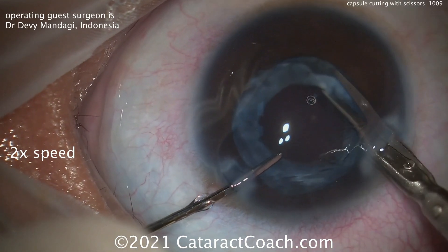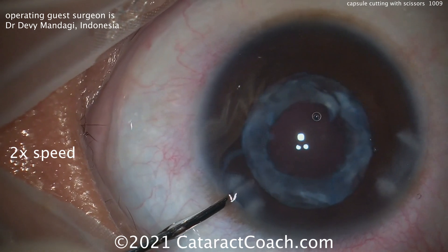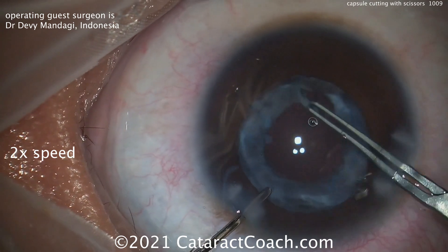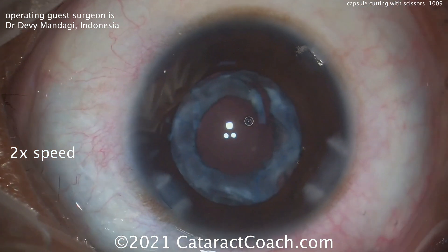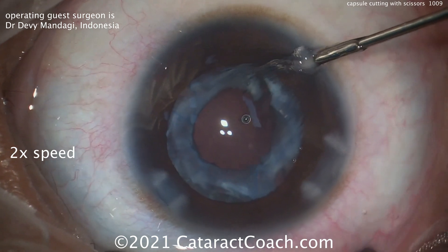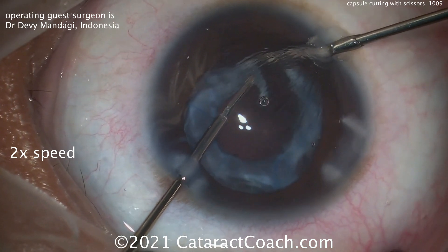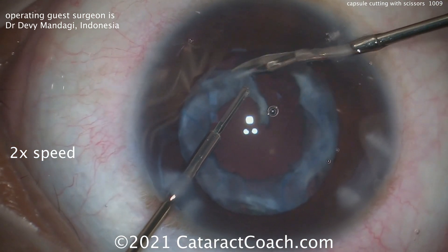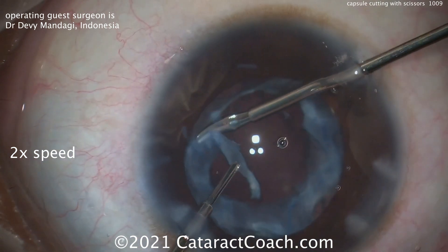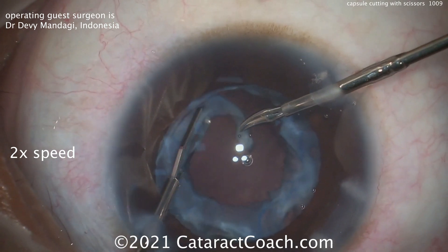Here's the end of the case. The capsular bag has been inflated with viscoelastic, and the capsular opening is going to be enlarged now. The initial one was quite small, and the pupil has since dilated up. An attempt to tear it again is not going to be fruitful, so it's best to make an extra paracentesis, placing micro scissors via that opening and going inside to continue cutting and enlarging this anterior capsular rim.